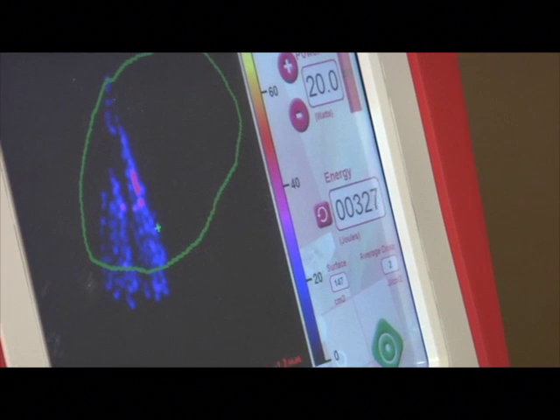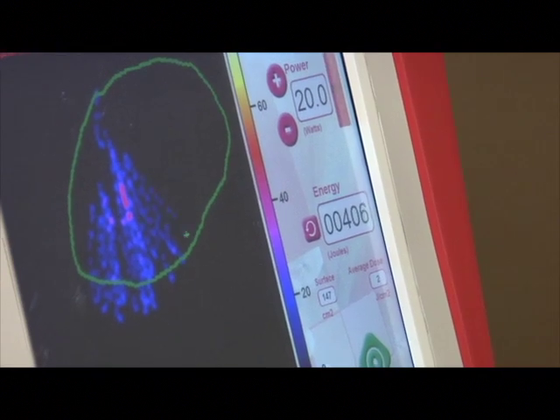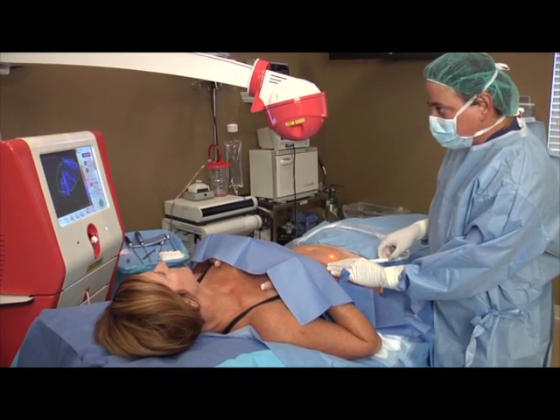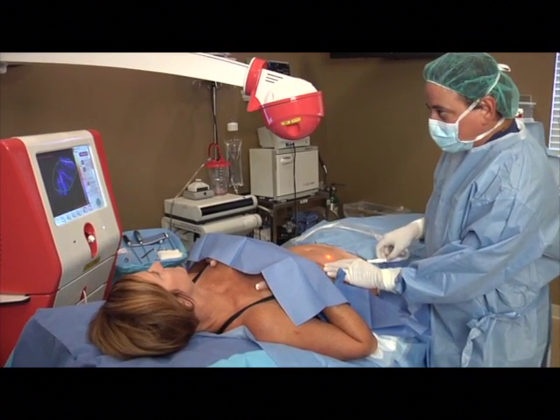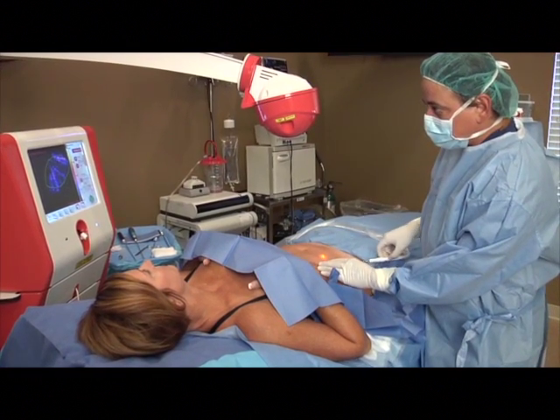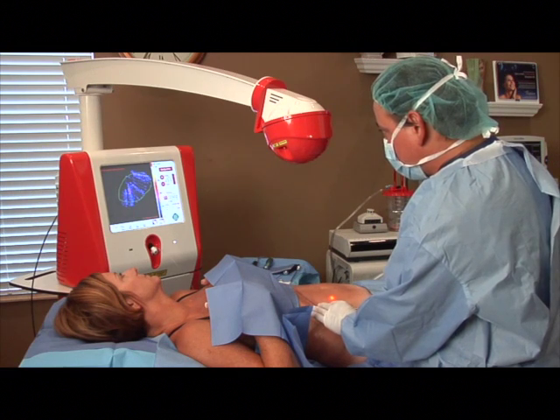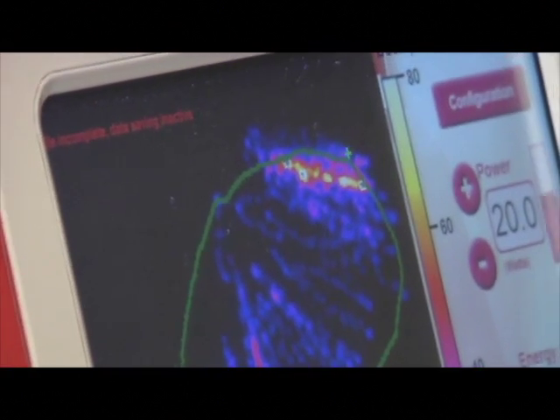And the camera head is following where the movement of my hand is. And the color screen is monitoring where the laser energy is being applied. And it'll begin to change colors as more energy is applied to each area. If you just stay in the same area like this, it begins to turn red, then yellow, and then eventually gray.